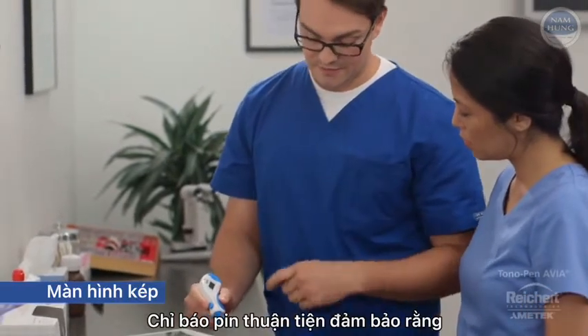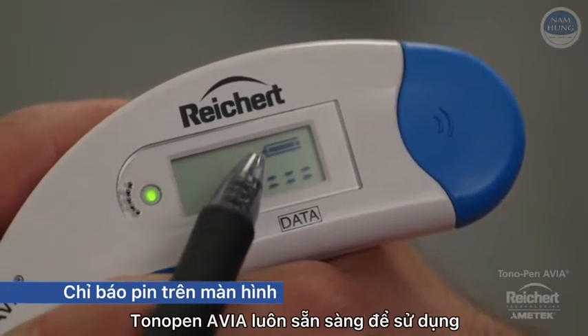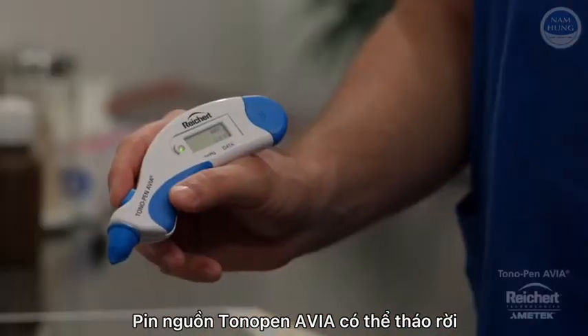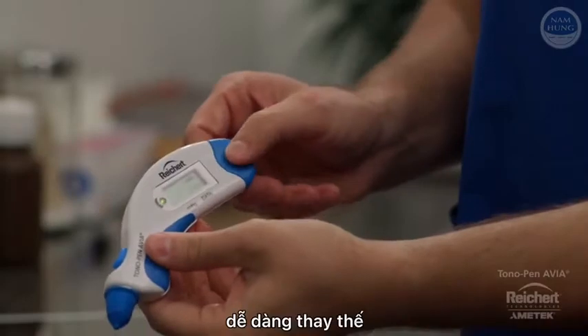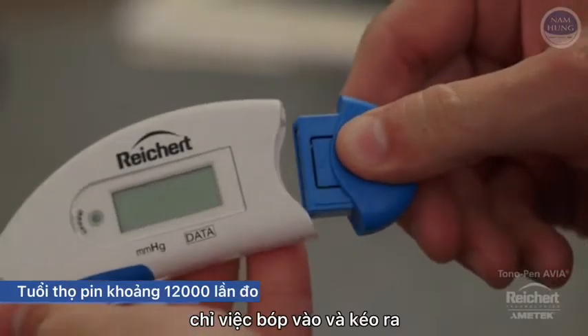The convenient on-screen battery indicator ensures that Tonopan Avia will always be ready for use. The removable Tonopan Avia PowerCell battery pack is easily replaced, requiring no tools — just squeeze and pull.